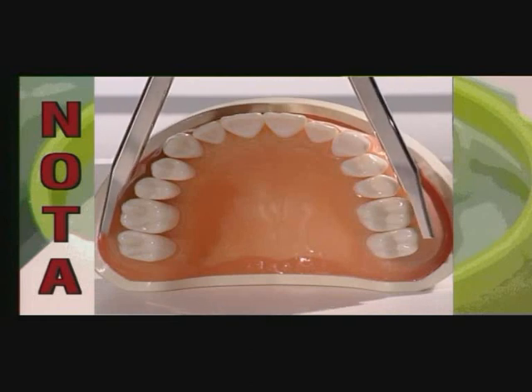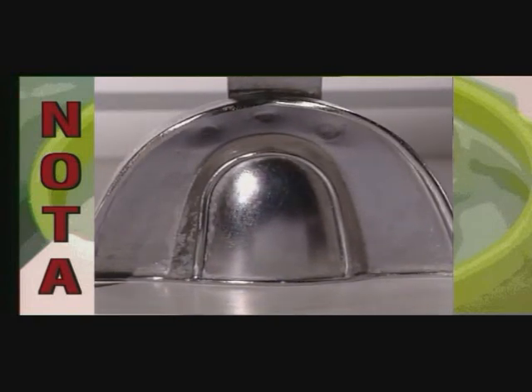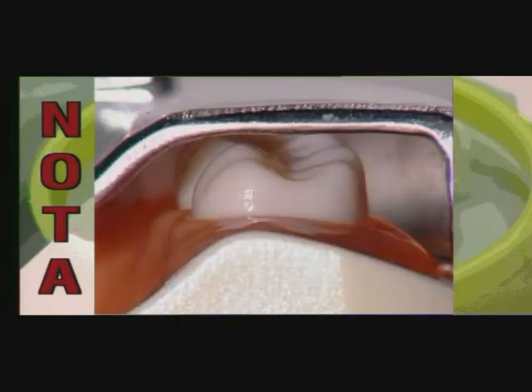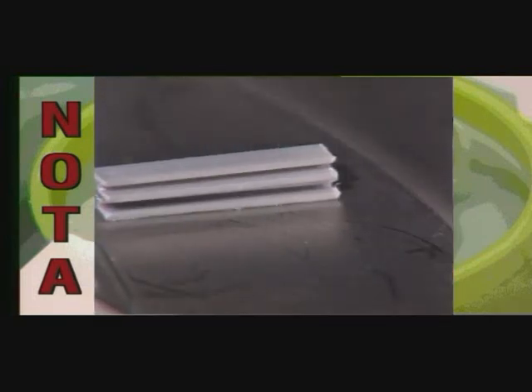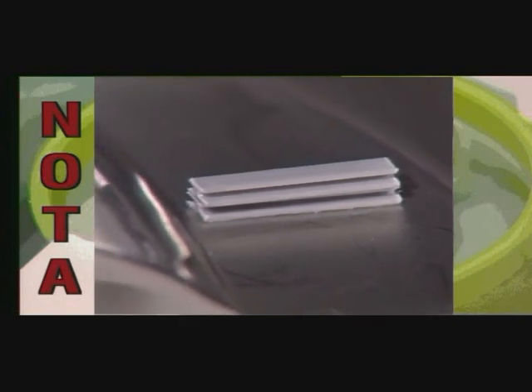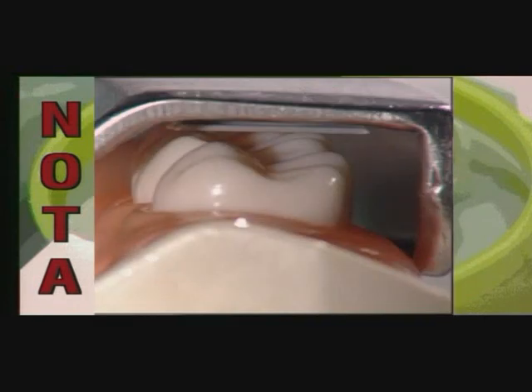To determine tray sizes, the extension of the dental arch is measured with a pair of dividers and the corresponding tray size then chosen. A layering thickness of at least 3 mm must be guaranteed to compensate for alginate's lack of elastic recovery and elasticity. To prevent extrusion and facilitate correct positioning, stops are inserted into the impression tray. They naturally guarantee the required distance.